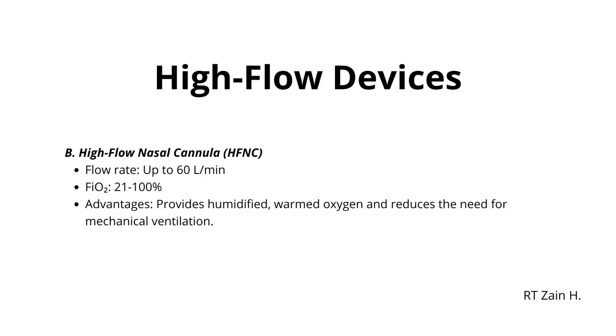B. High-flow nasal cannula, HFNC. Flow rate, up to 60 liters per minute. FiO2, 21 to 100%. Advantages: provides humidified, warmed oxygen and reduces the need for mechanical ventilation.